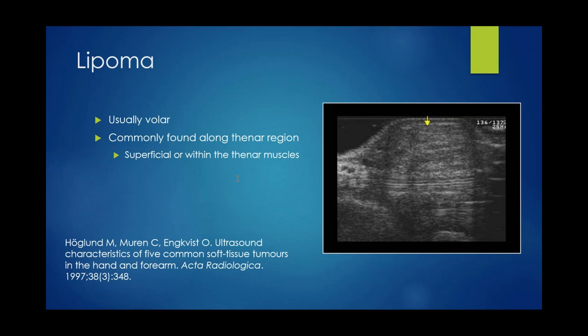And then we have one last one. Do you see a difference in outcomes for carpal tunnel intervention between standard surgery versus ultrasound guided surgery? Right, so there's a number of studies looking at outcome measures. Traditionally, the Boston Carpal Tunnel Questionnaire, as well as the Quick Dash surveys, have been used when looking at the ultrasound guided release procedures, as those are typically the same outcome measures that would be used in either the open or endoscopic release. And as far as I understand from the review of the literature, and having done a study on myself, the outcomes are comparable.